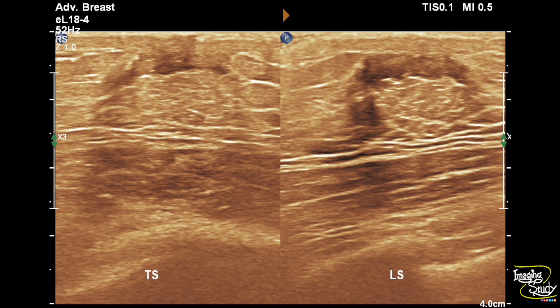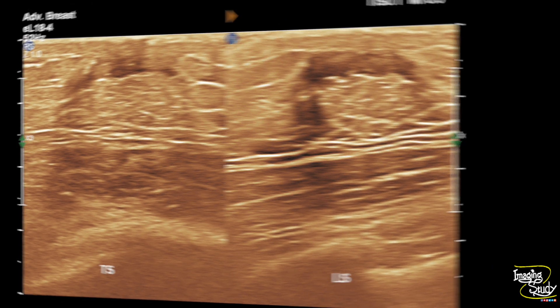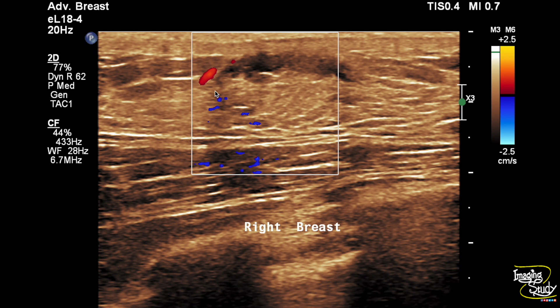Here we have used the high-frequency linear transducer to evaluate the right breast, which was apparently normal. You can see there is no fat plane irregularity and no development of a dense mammary layer. We applied color Doppler and there was no aberrant vascularity within the right breast region.